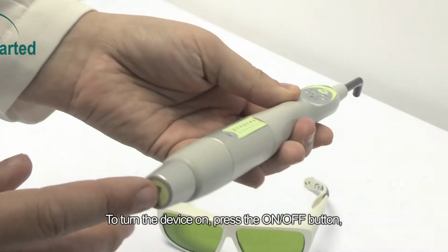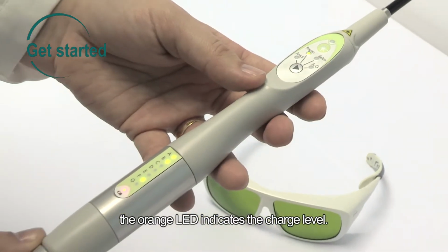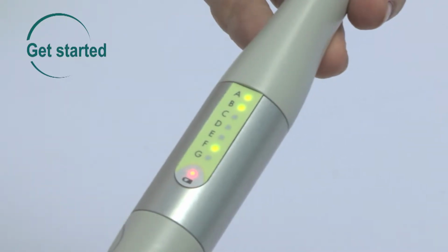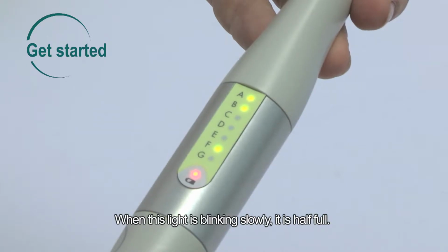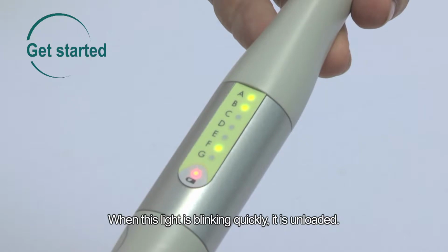To turn the device on, press the on-off button. The orange LED indicates the charge level. If the orange indicator light is steady, it is fully charged. When the light is blinking slowly, it is half full. When the light is blinking quickly, it is unloaded.